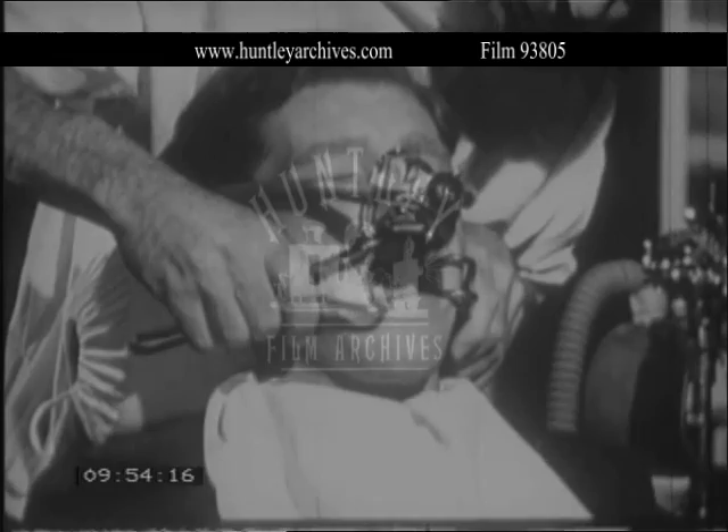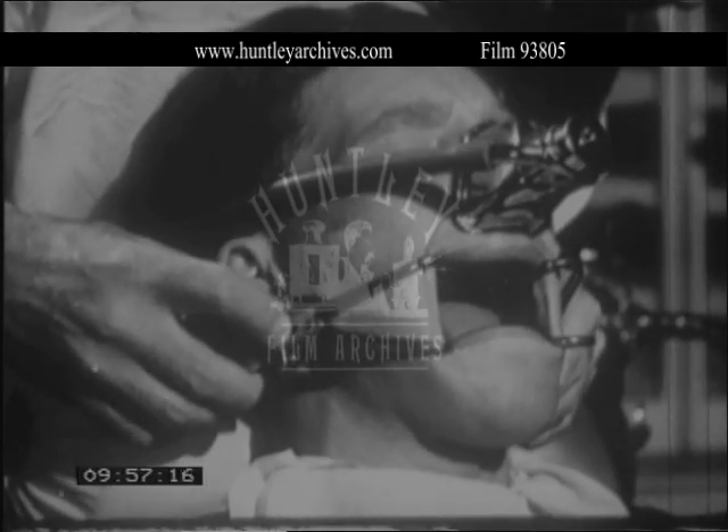By opening both slowly with an even pressure, the risk of damage to the teeth or more serious injury to the mandible is diminished.